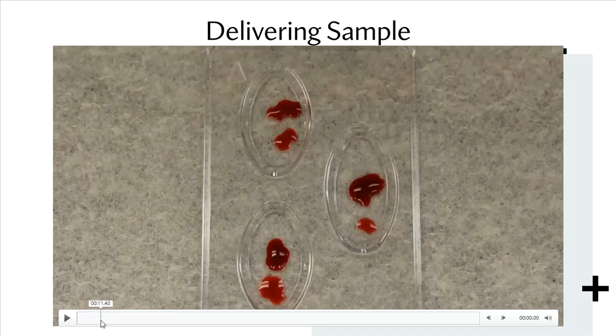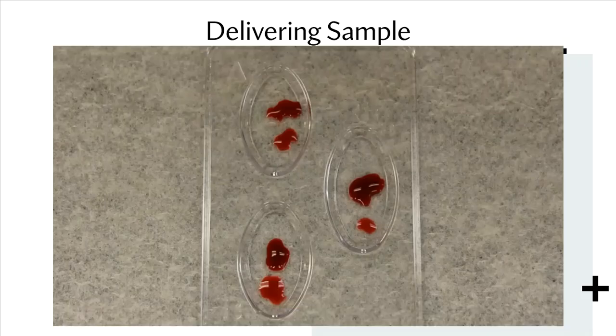So in this video, we've already delivered our sample, but now we're going to be adding our anti-serums to the wells.